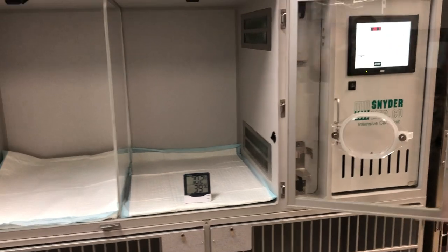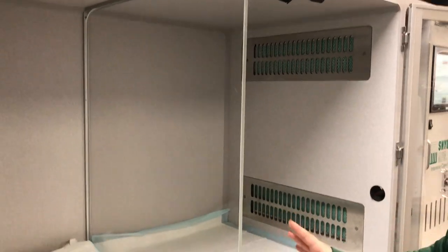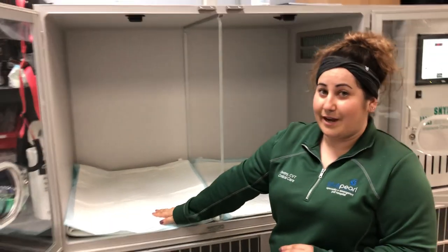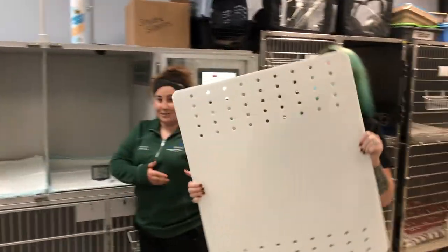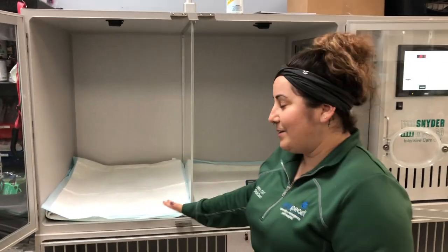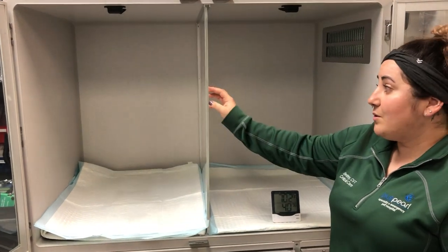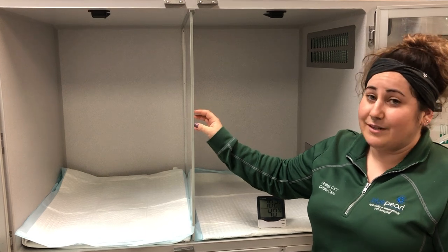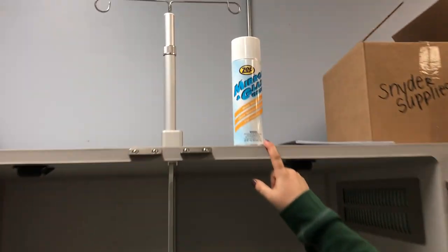The unit comes with two different dividers and can also be used without a divider. A solid divider means a patient cannot go on that side of the unit. It also has a ventilated divider if you have two different patients you would like to put in the unit. Anything that is plastic or acrylic cannot be cleaned with Kennesol or anything abrasive because it will dull the acrylic and the dividers — it must be cleaned with glass cleaner.